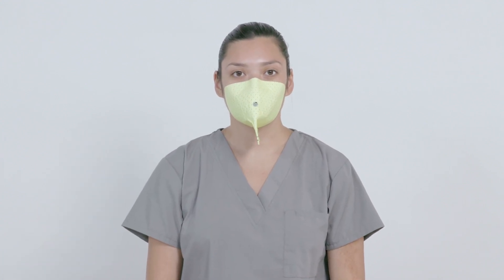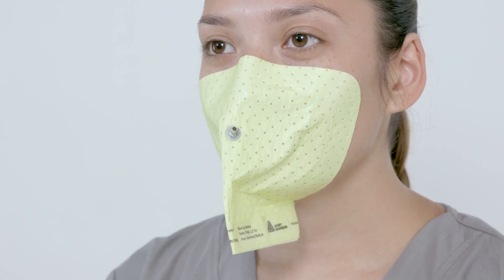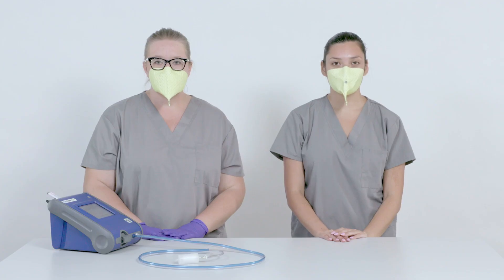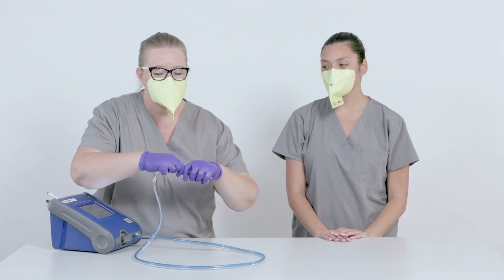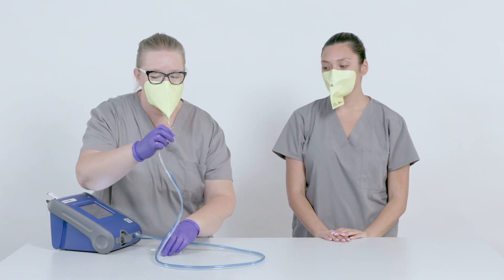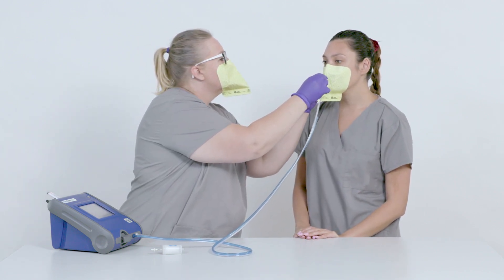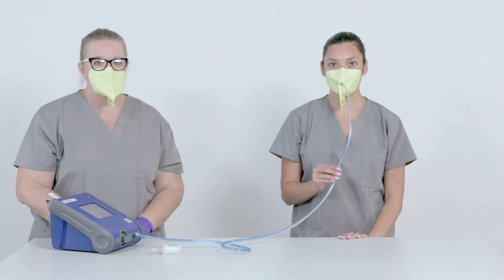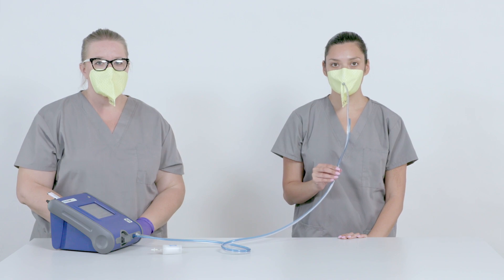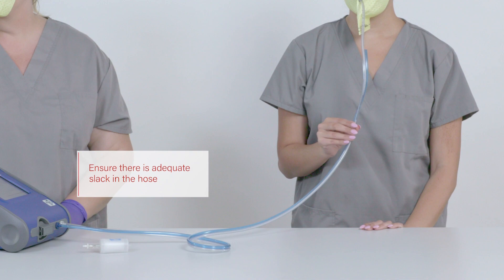Have the test subject breathe in and out deeply — the mask should inflate and deflate with these breaths. Once confident of a proper seal, the test can begin. Attach the clear hose to the probe on the mask. Have the test subject hold the hose to prevent pulling on the mask; this hose should be held for the duration of the fit test exercises, especially when bending over at the waist. Ensure there is adequate slack in the hose to avoid pulling on the mask or risking disconnection during test movements.